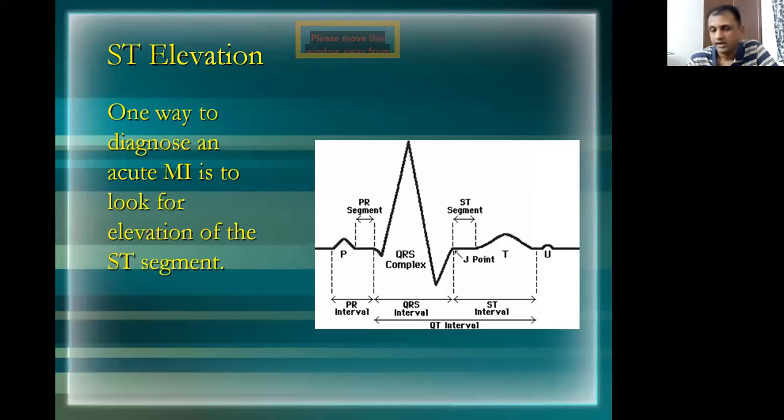Okay, so the main reason we do an ECG is that somebody comes with a chest pain. You're the admission day doctor sitting in the casualty, and the first thing you ask for is an ECG. When you order any test, we should have an idea why we do it. ECG can bring out a lot of diagnoses just by doing a surface tracing. The main thing is to diagnose acute myocardial infarction, or a heart attack. ECG is the main cardinal test used.